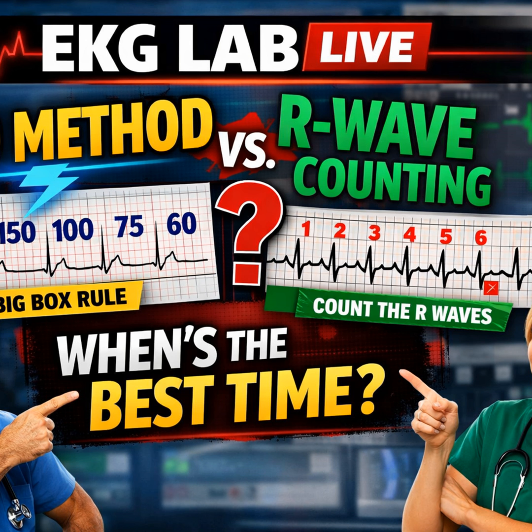That NIH paper on high-risk decision-making talks about recognition-primed decision-making. It's how firefighters and ER docs make split-second choices. It's based on pattern matching, not calculation. Go on. Well, when a patient is coding, your adrenaline is through the roof. Your working memory shrinks. Asking a clinician to recall 300, 150, 100, 75, and then trying to interpolate between boxes while people are shouting, you're just asking for an error.